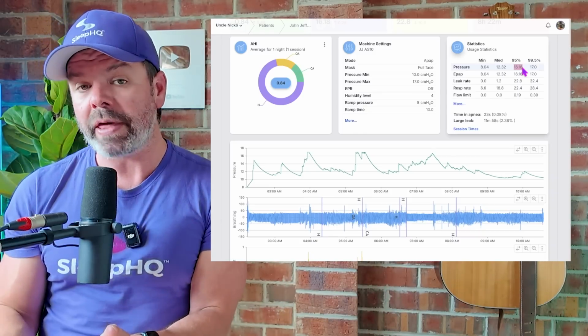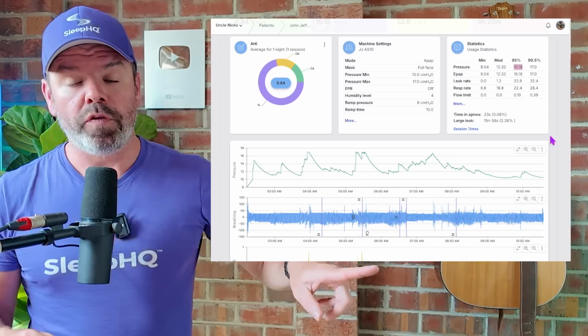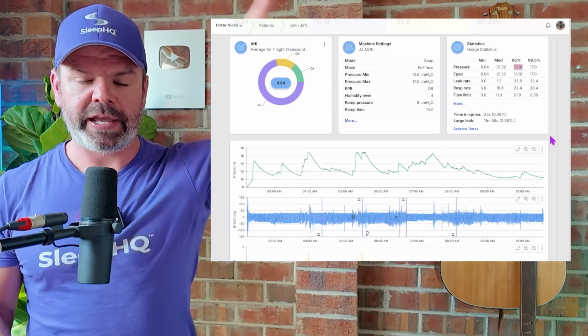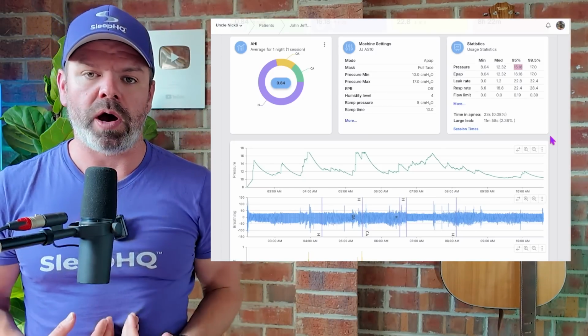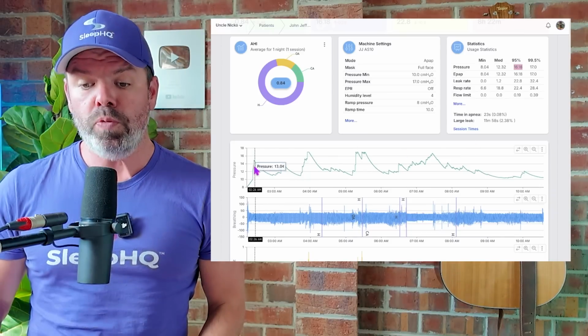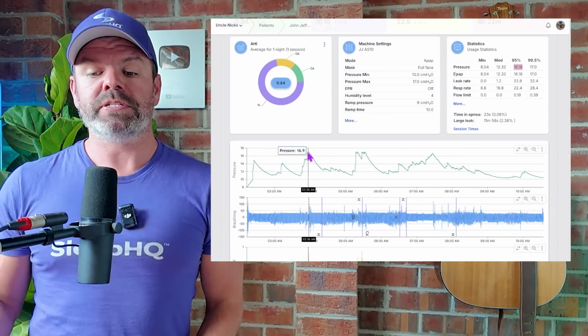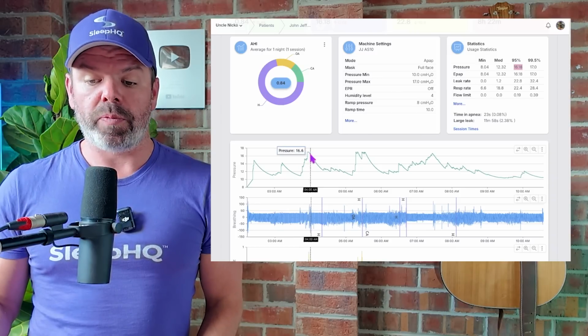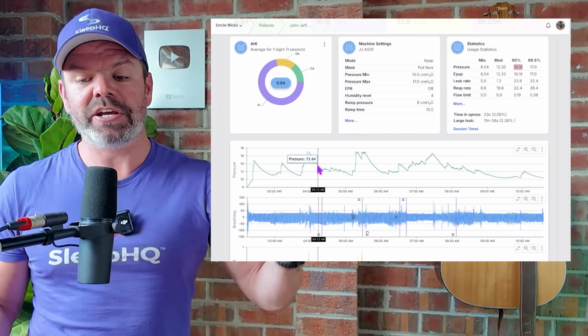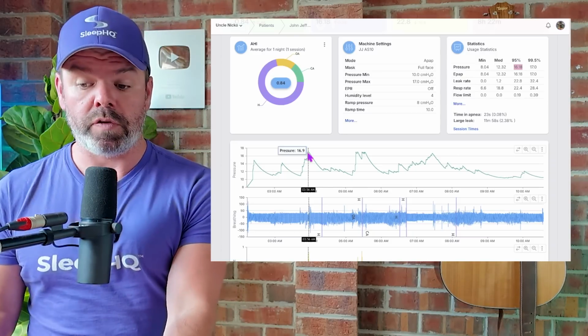All right, and one thing about the ResMed automatic algorithm is it is extremely aggressive. It often provides too much pressure. It overshoots what's required for regular breathing. And you can see it. I mean, look, as soon as it goes whoop, it starts to come back down. It got it wrong. Whoop, up to 17, straight away drops back down. Did it need to go to 17? Probably not. All it did was cause a lot of leak.